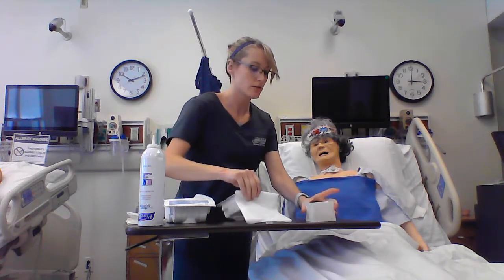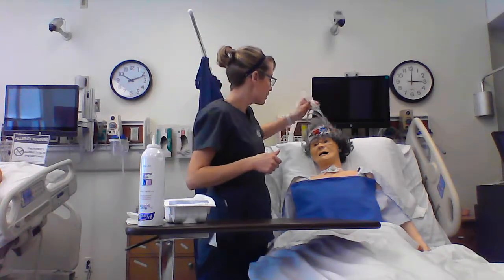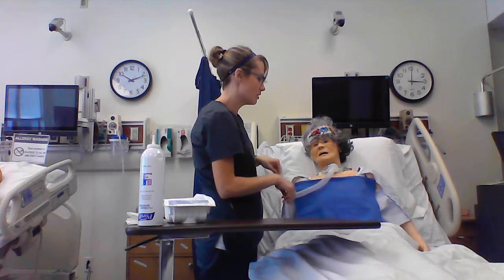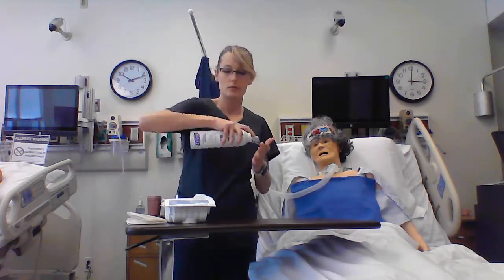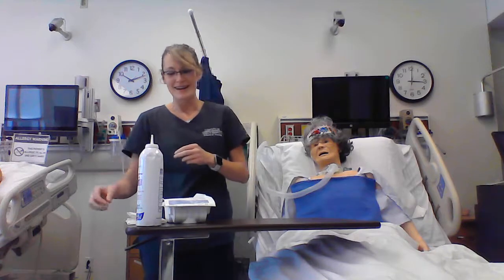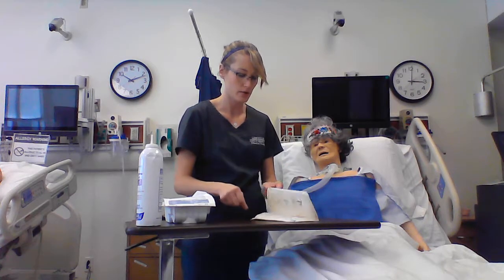You can take and turn her suction off at this point in time. Throw away these supplies that you no longer need. And pull her mask back down and reoxygenate her while you set up your next field if you need to. Some patients do fine without. And then re-clean your hands. Hand hygiene. It's very important. And we're going to don a new pair of sterile gloves. So again, these are in a package. Open the package up. Pull these out.